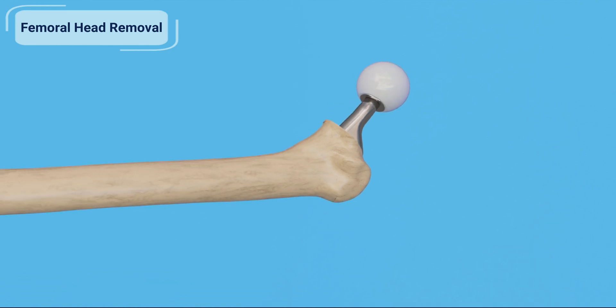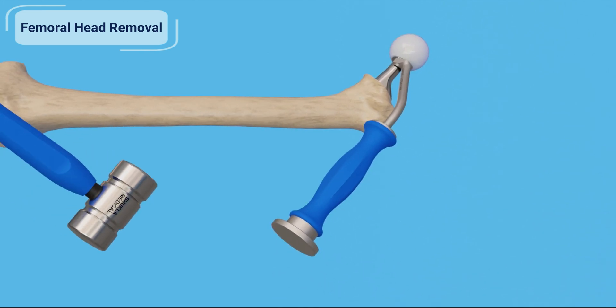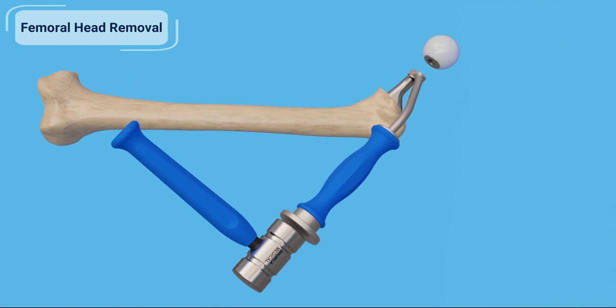Position the femoral head punch against the femoral head of the hip stem. Slide the femoral head punch onto the neck of the hip implant. Use the mallet to strike the impact cap of the femoral head punch to dislodge the femoral head from the hip stem.